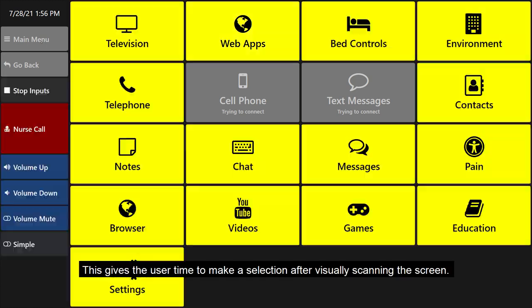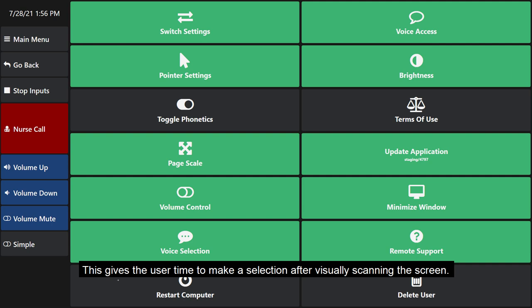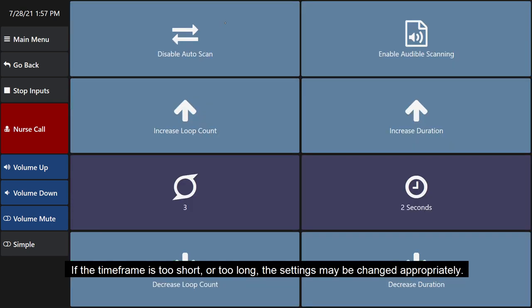This gives the user time to make a selection after visually scanning the screen. If the time frame is too short or too long, the settings may be changed appropriately.